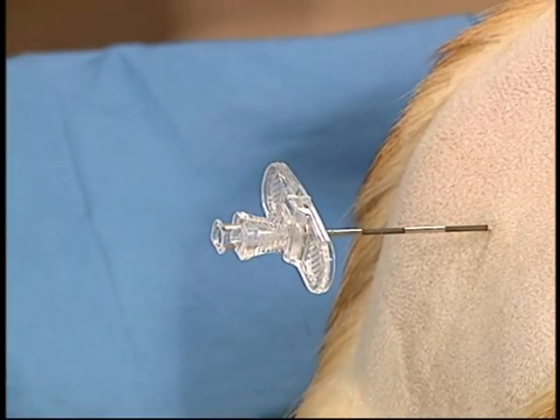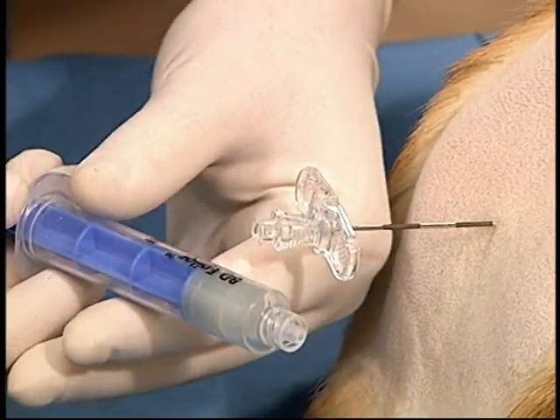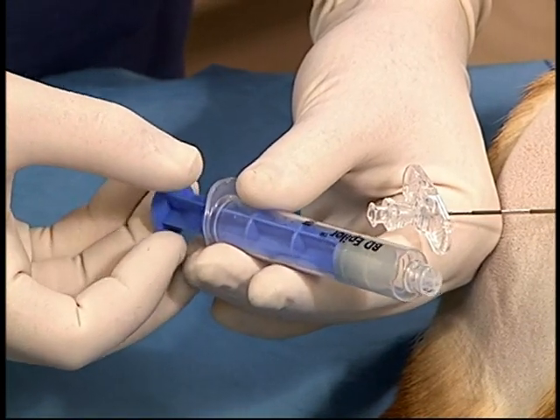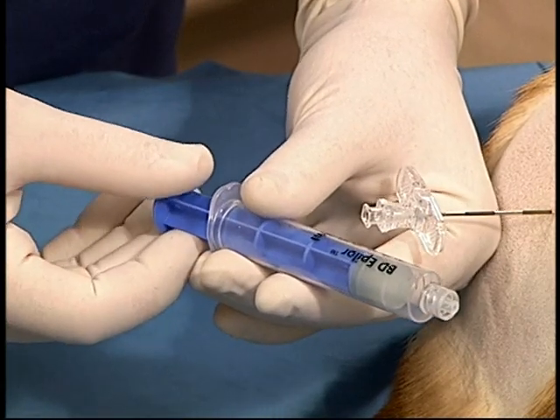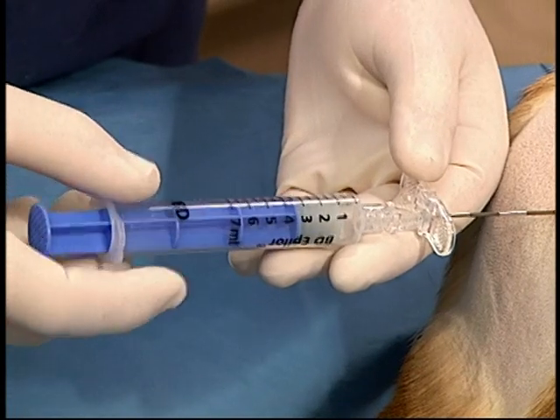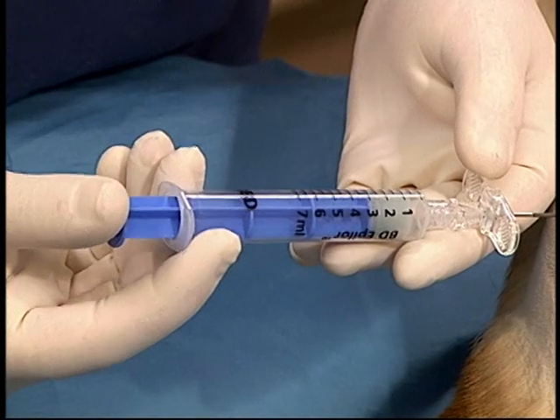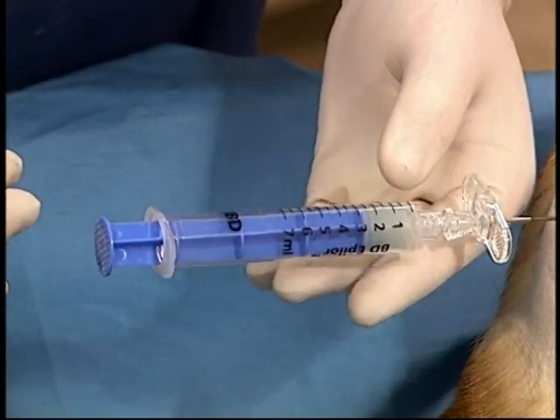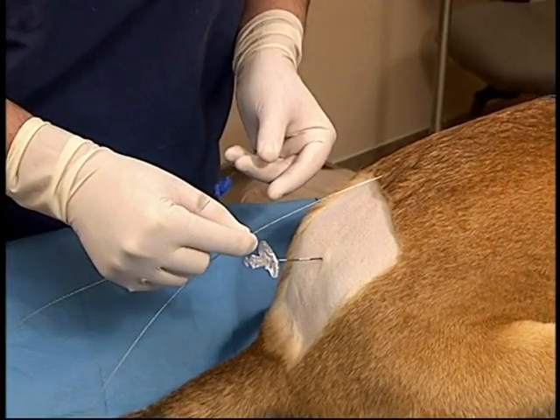The hub of the needle is inspected to ensure no spinal fluid is seen. Air is injected into the needle to ensure it's in the appropriate location. A specially designed Teflon-coated syringe is provided in the kit that has no resistance to the passage of air. This syringe is attached to the needle and approximately 1 cc of air is injected into the needle. If there is any resistance on the plunger of the syringe, the needle is in an inappropriate location and should be reinserted. Once the position of the needle has been confirmed, the catheter is inserted.